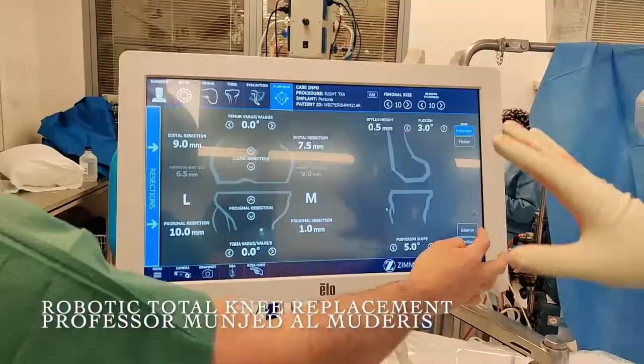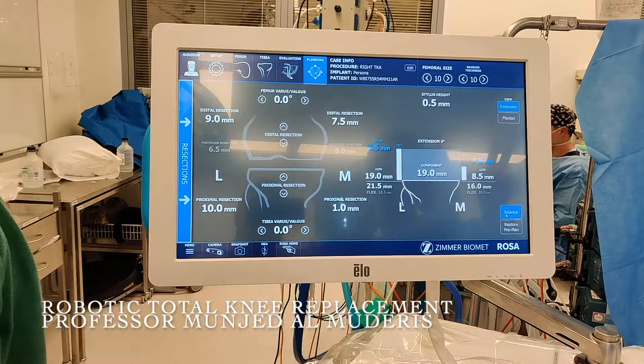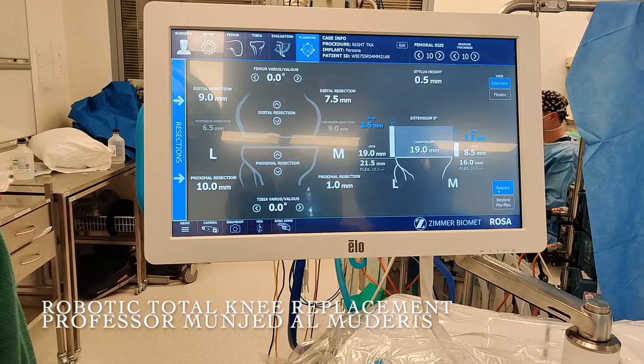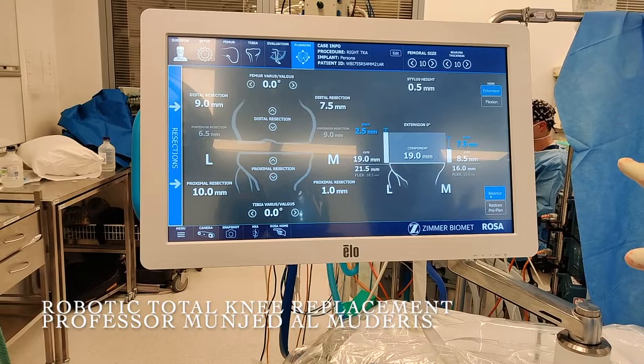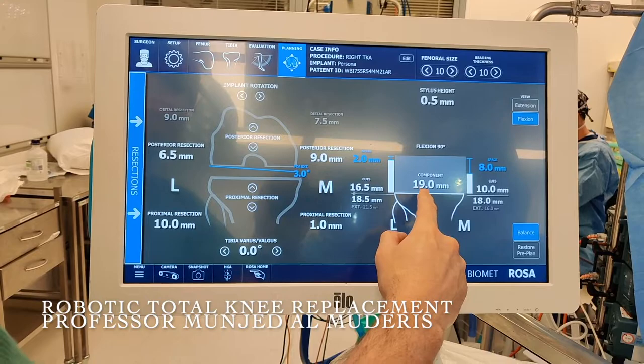The platform gives us an indication of where the robot will decide to cut. This information combines pre-loaded images from before surgery with intraoperative data, and the computer calculates and balances the position of the femur on the tibia. At this point, we are still a little tight medially in extension compared to laterally, and relatively balanced but slightly tight in flexion. We have a 19mm component to seat inside this bone.